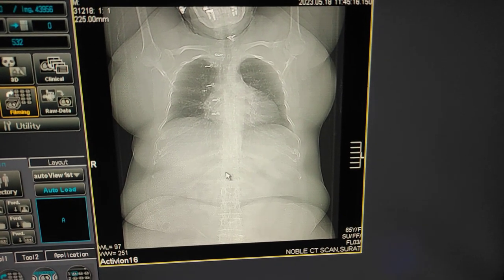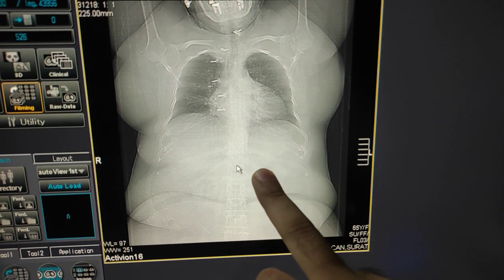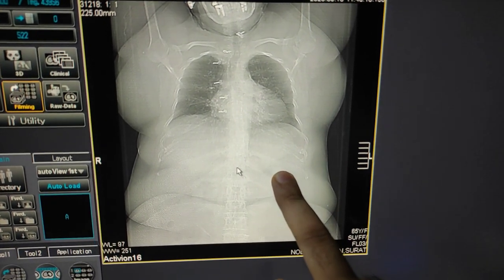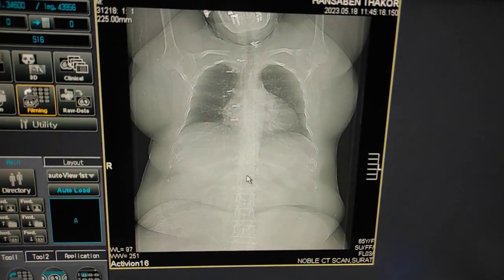The reason I am scanning from the diaphragm is that sometimes by the time the scan reaches the upper chest, the patient cannot hold their breath properly and images will show motion artifacts. That's why I am scanning from diaphragm to apex, though you can also take it from apex to diaphragm — it's up to you.